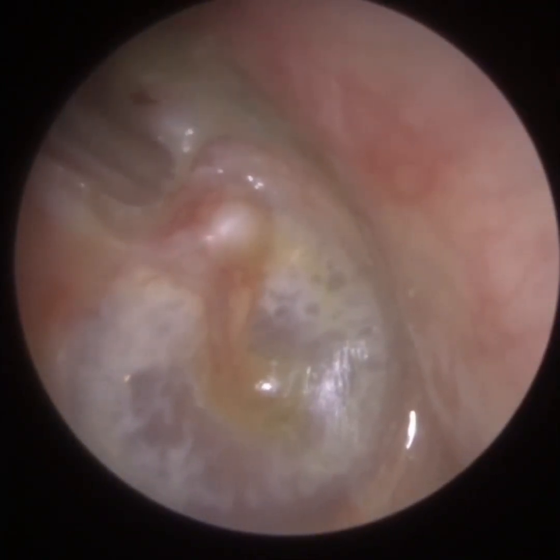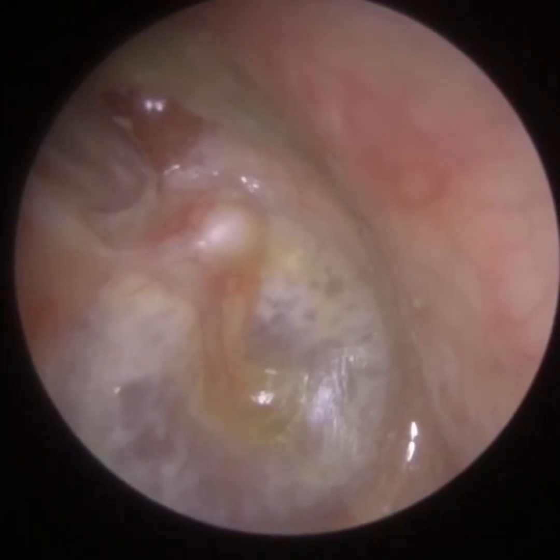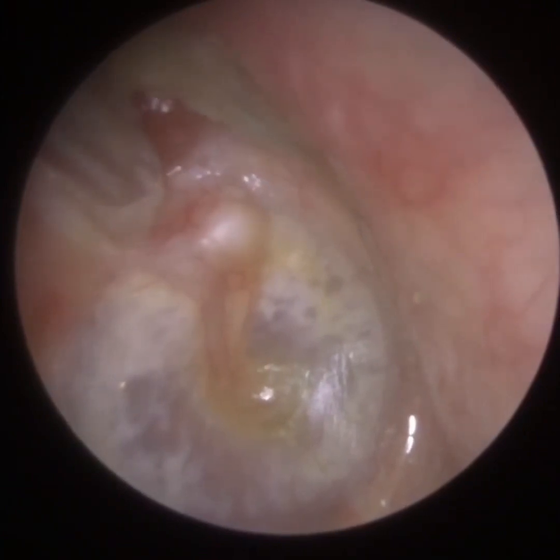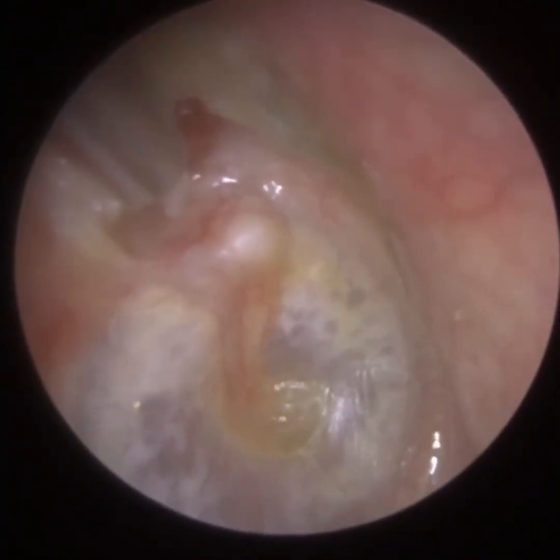I'm just slowly approaching it. So, what is a cholesteatoma? A cholesteatoma is a collection of dead skin cells that typically collects in a retraction pocket. Your eardrum — if you think of it like cling film — can easily get sucked in if you've got negative middle ear pressure behind the eardrum.